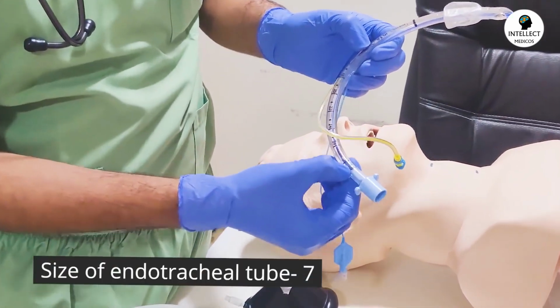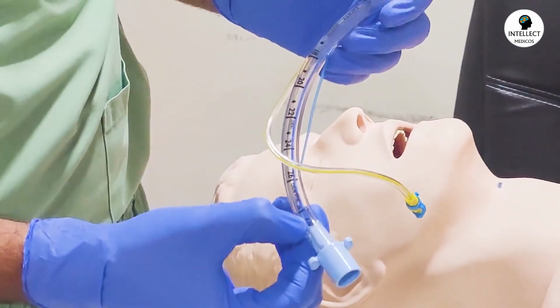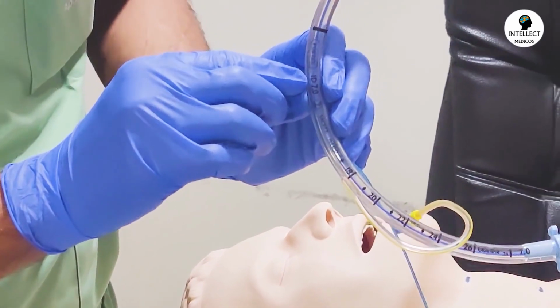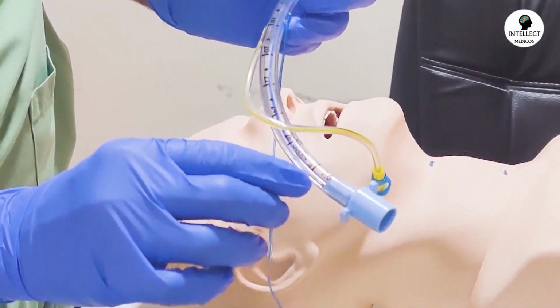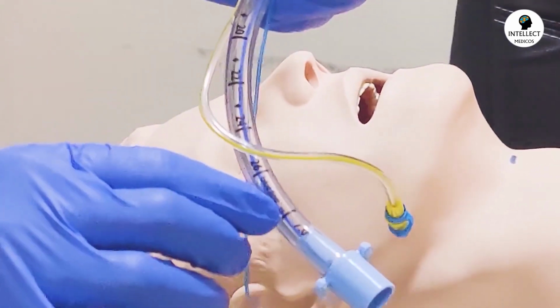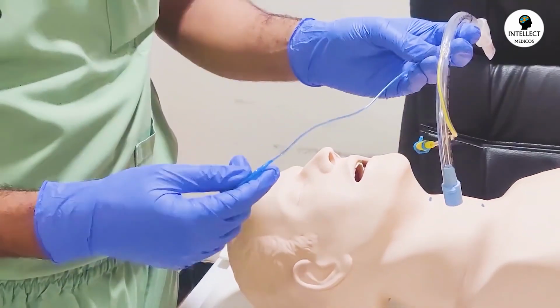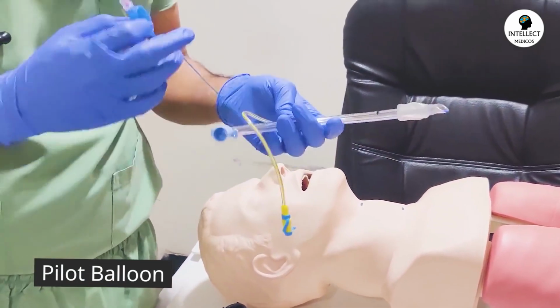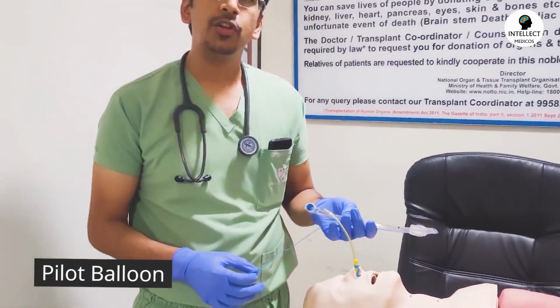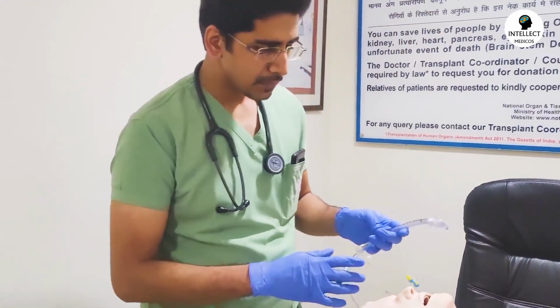And this 7.0 suggests the size of the endotracheal tube is 7. That is the internal diameter. It is written over here as ID 7.0. And starting from 18, it goes till 26 centimeters and 28 centimeters. This is called the pilot balloon. From here, you can inflate the cuff. In an adult population, we try to intubate a patient with a cuffed endotracheal tube so as to prevent any kind of aspiration.